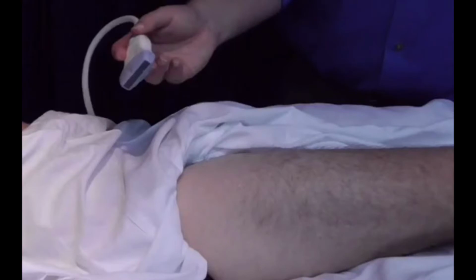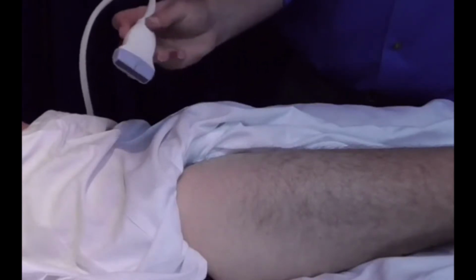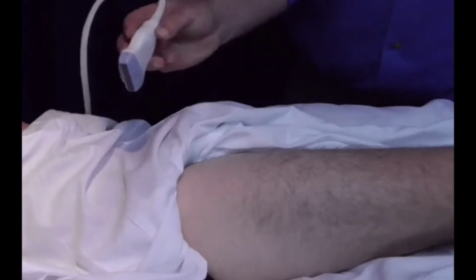For the DVT exam, we're going to use a high-frequency linear probe. We're going to demonstrate a 3-point compression technique for detecting proximal DVT. The probe is going to be placed just below the inguinal crease with the probe indicator facing to the patient's right.